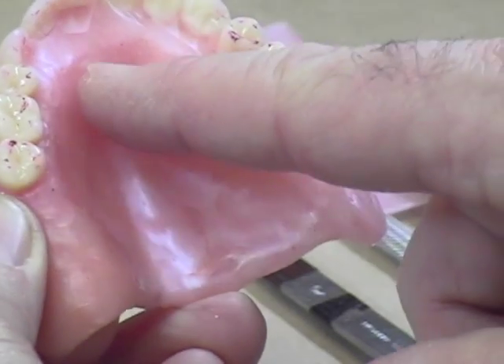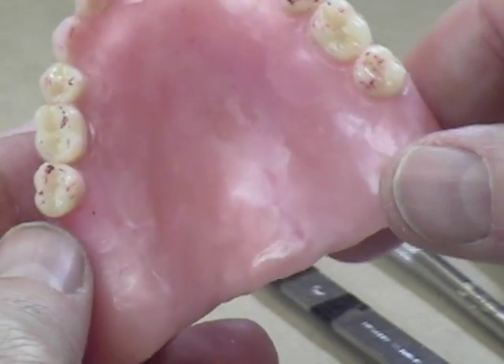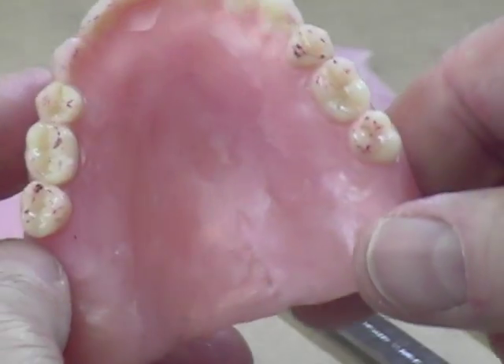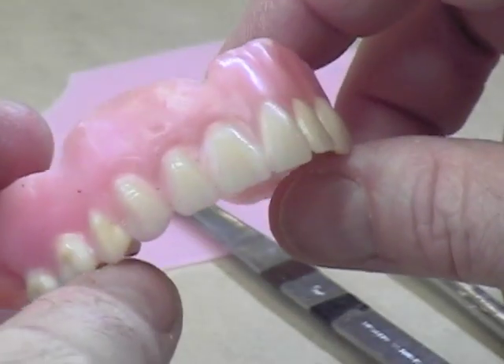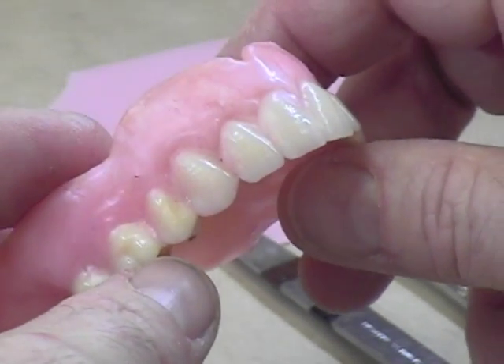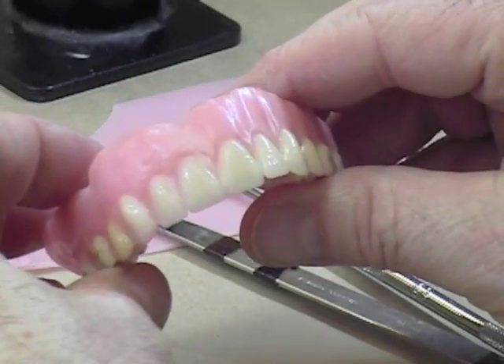If you've got any powder or markings from the articulating paper, it's nice to get those off before you start melting the wax. Otherwise, you can get dark black markings or red markings in the wax and that doesn't look so good. So we're going to get started with the maxillary denture here.